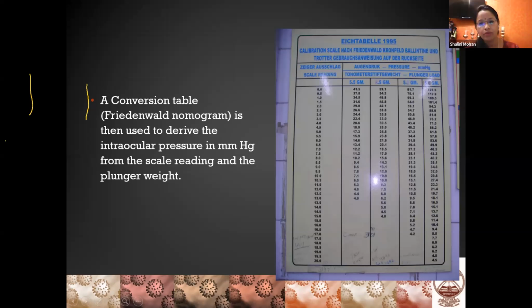So the question is, if the readings of Schiotz are not as accurate as Applanation, are there still indications of Schiotz tonometry? So let's see the advantages. Advantages are that it is very user-friendly. Second, it can be used by anyone very easily. The learning curve is very small, and it is portable and affordable also.